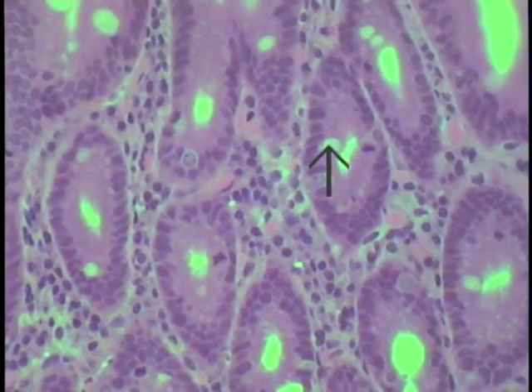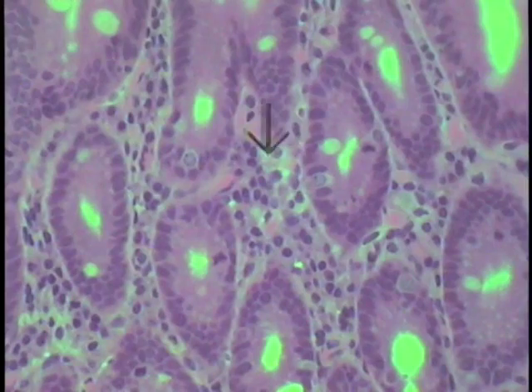There's a goblet cell shown here, but what one should pick up on are these light staining cells, another light staining cell here with basically very light dust-like granules, another cell shown here, and another one in this particular area here. These are all species of the enteroendocrine cell series, though we do not know what type unless we stain the granule specifically.